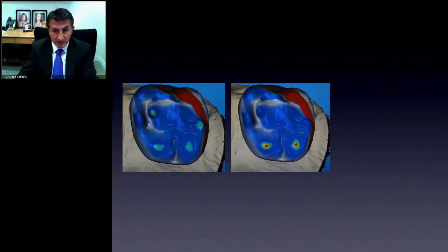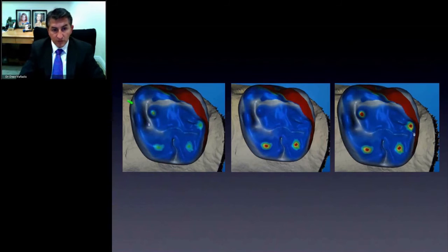Now, when we look at our occlusal analysis of our restorations, what better way to control our occlusion, making it lighter, making it lingualized, making it in 4-point contact, than with a digital computer? The precision of these systems is so good that you can get this to 80 microns, to 40 microns, to 10 microns, and when you mill it, that crown is going to come out to that specificity. Now, each system has a different tolerance. So my machine may be red equal to 85, and somebody else's machine may be red equal to 65 microns. That's just a calibration issue that once you know your system, you'll be able to get your occlusion dead on, so that when you're trying on your crowns, you're in a much better state than we were by using models and casts.